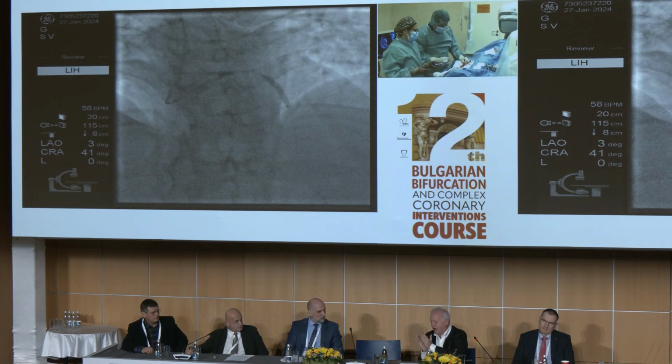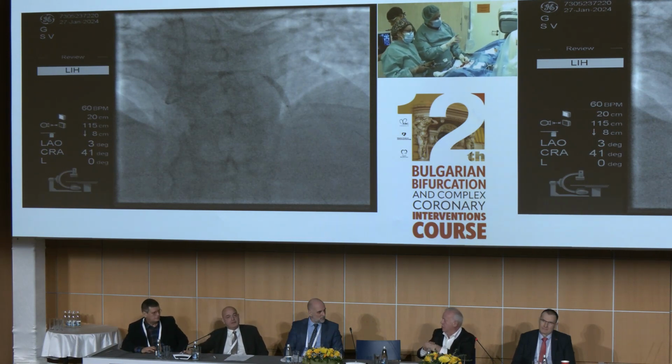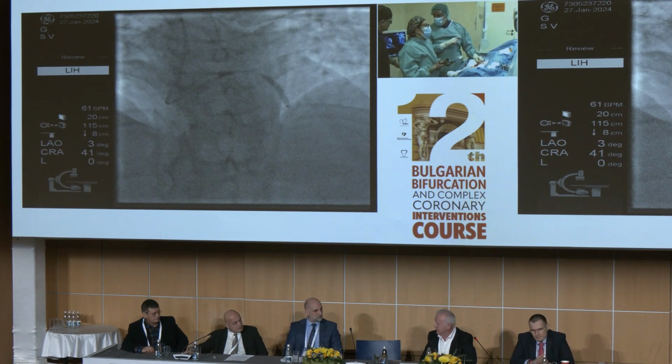But 30 seconds, you are under the diameter proposed by the company. So you are not on the wall if you have well measured your diameter. So you inflate a second time. Then you have the diameter proposed by the company. Now, if we need 3.5, we will show you a maneuver to be sure that the distal stent is well opposed, for the POT.